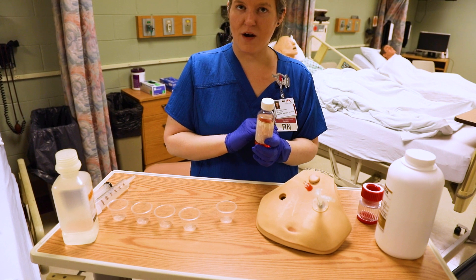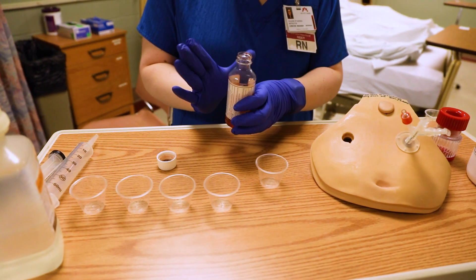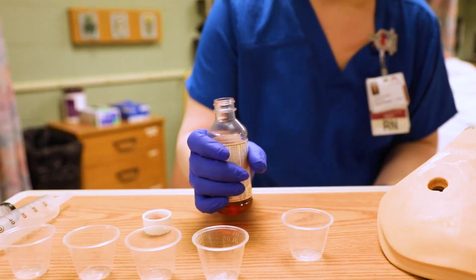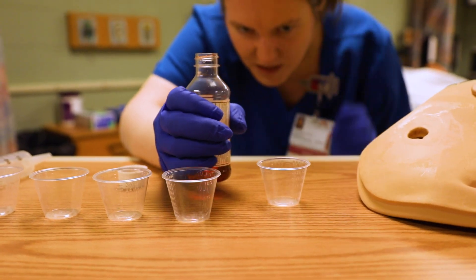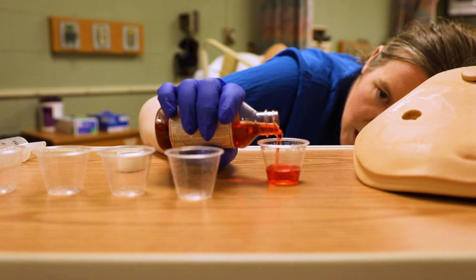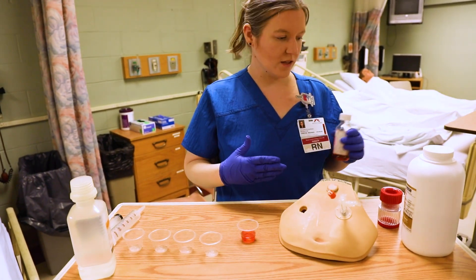The first one we're going to do is a liquid medicine. When you do a liquid medicine, your hand needs to go over the label so that if any meds drip down, it doesn't destroy the label. When pouring, you need to be at eye level with it flat on a table. The doctor ordered 10 cc's of this liquid, so I'm going to pour nice and slow — I got exactly 10 cc's. You cannot go above or below, because that would be over- or under-medicating your patient.